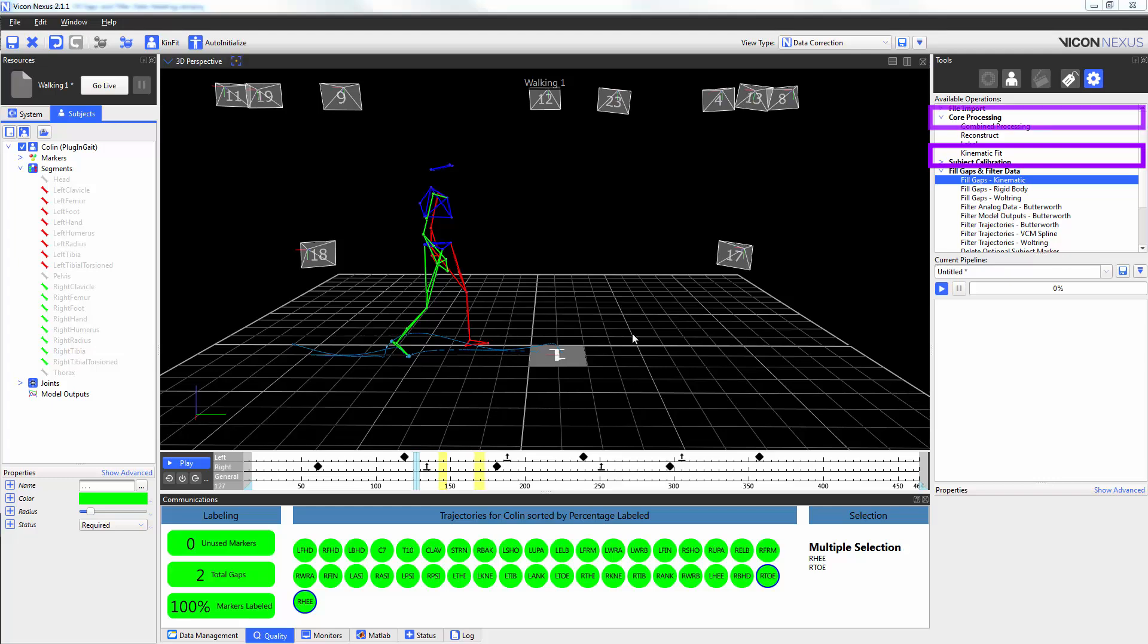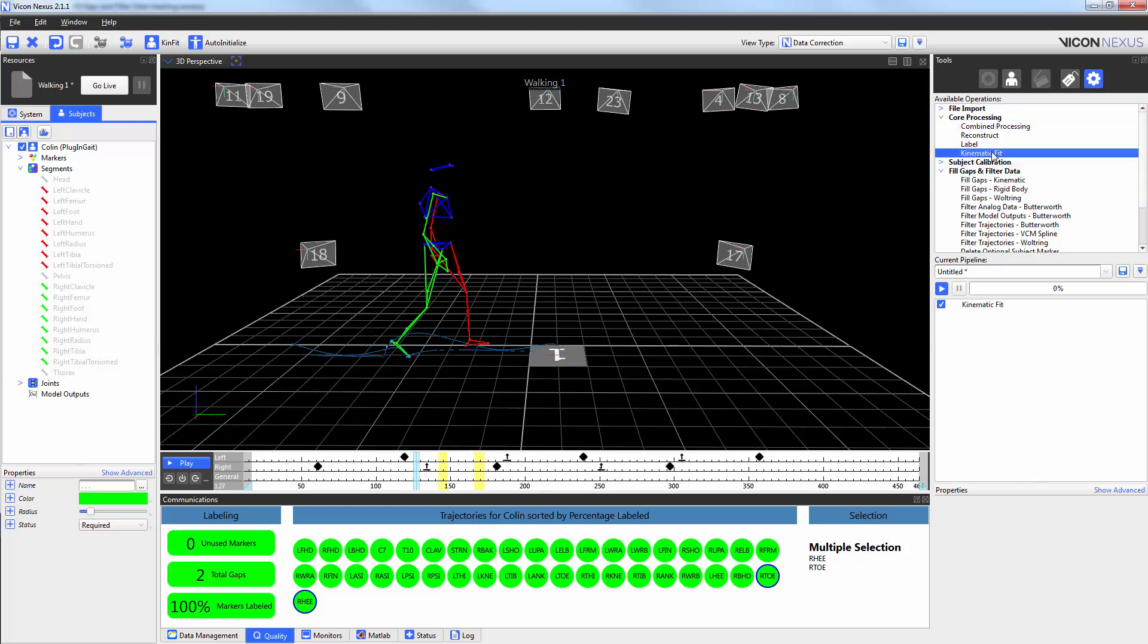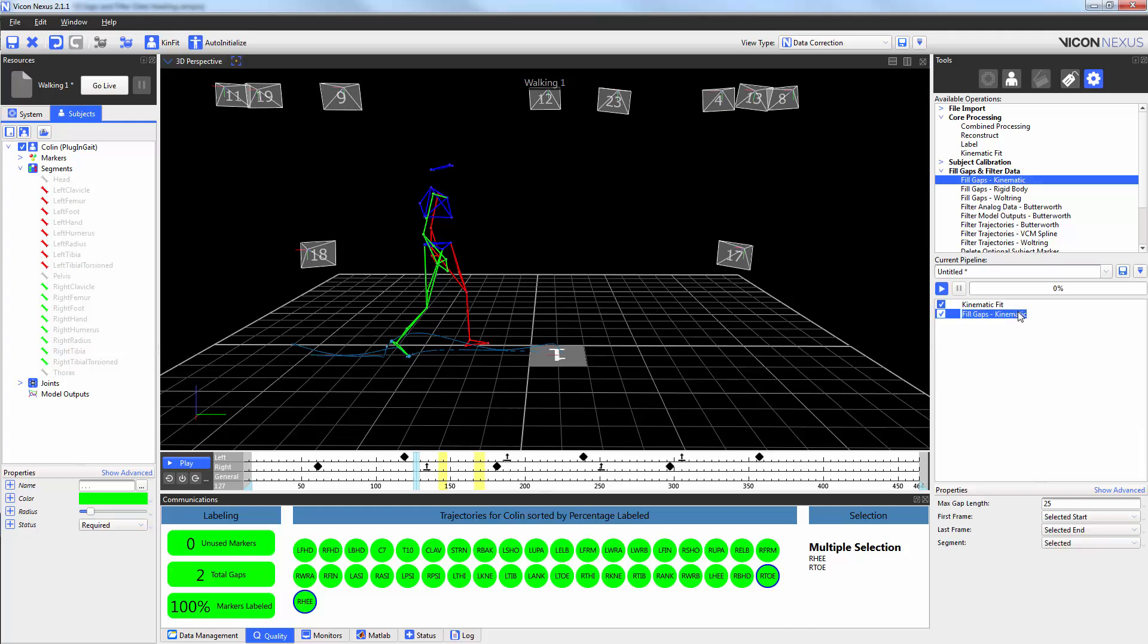So I'm going to add that to my list. Now, I'm going to add my fill gaps kinematic pipeline operation. Again, like before, I'm going to double click here and call this the right foot.